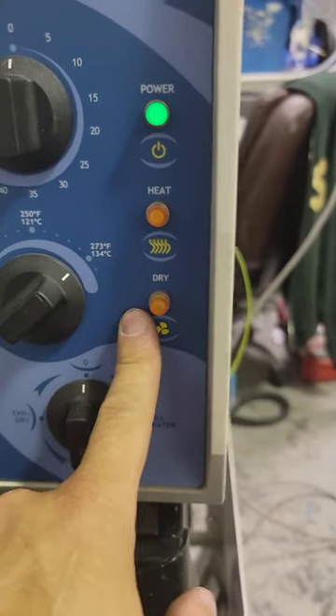No heat light, because it's going to be heating on. It's not drying, because it's going to be drying on. Next, you need to open the door and look in here.